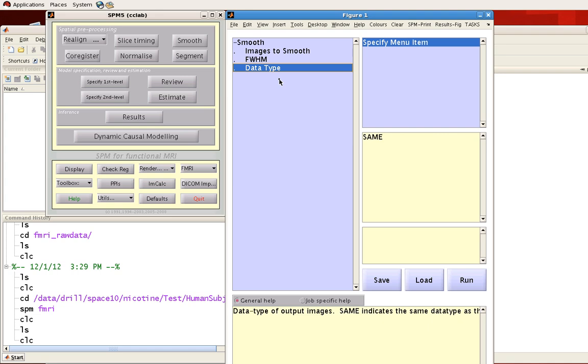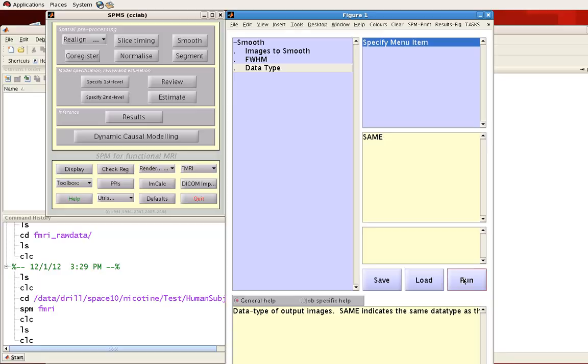And for data type, you can just leave that as the default. Go ahead and click Run. And it should only take a few moments for smoothing to complete for your functional dataset.